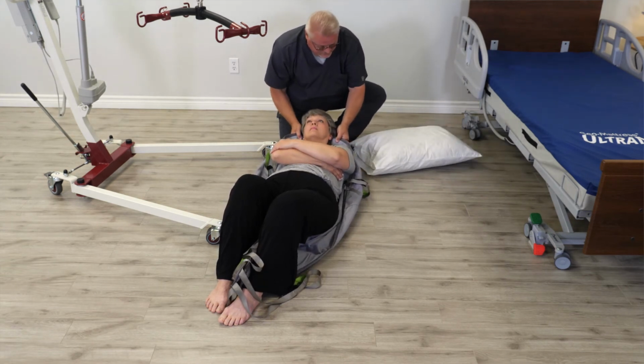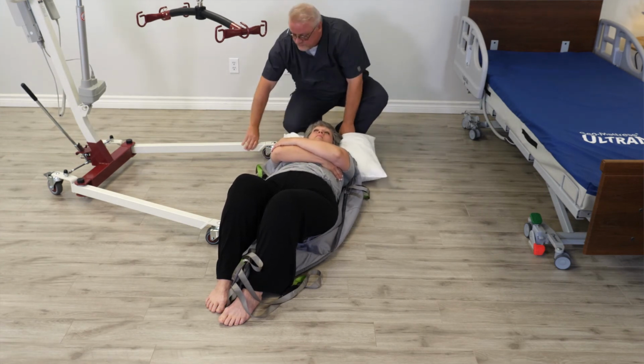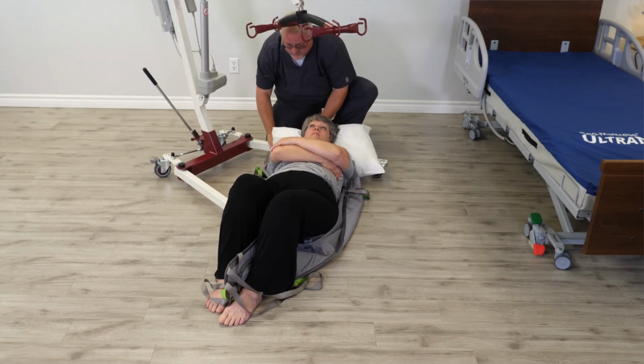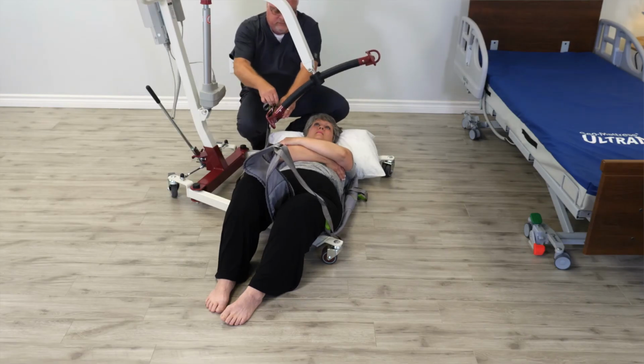Run one leg of the lift under the bent knees and maneuver the other leg up near the top of the head. Use a pillow under the sling or have another caregiver help protect against bumping with the casters. Lock the casters and secure the loops to the spreader bar.